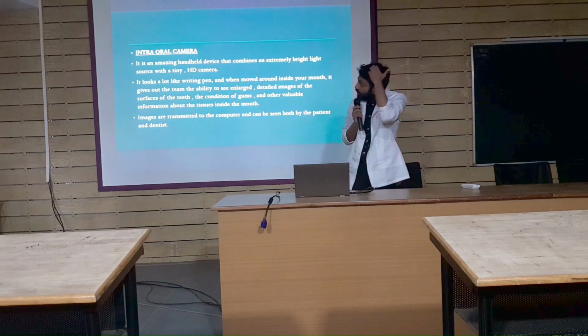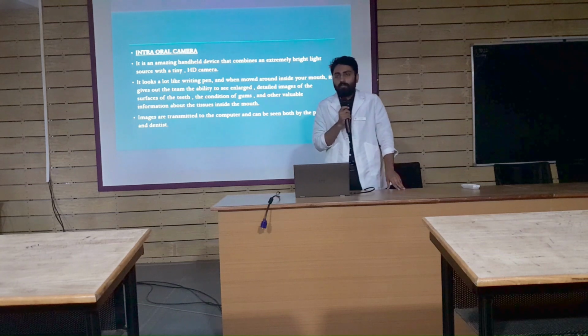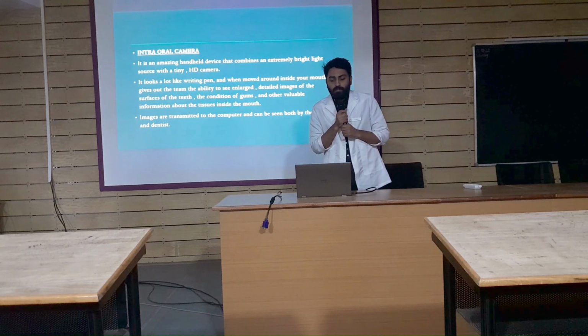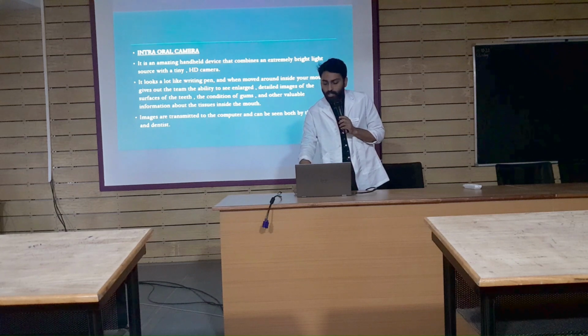These intraoral cameras can be used chairside to convince the patient about what they have, what all lesions we see inside the oral cavity. Then images are transmitted to the computer and can be seen both by the patient and dentist.